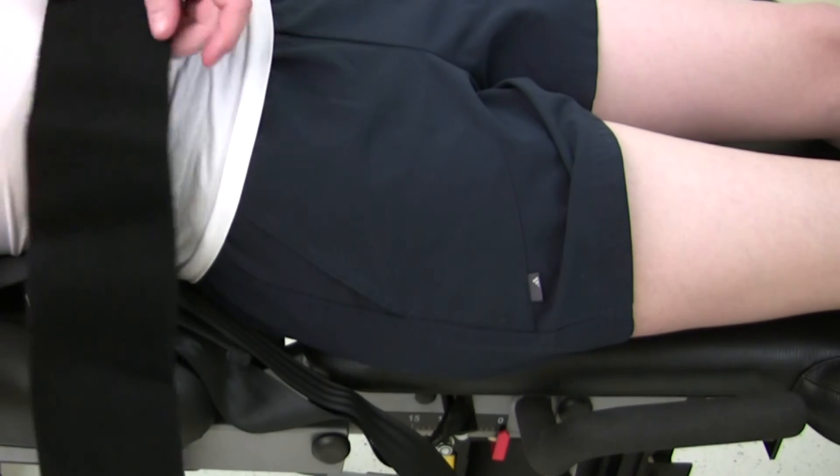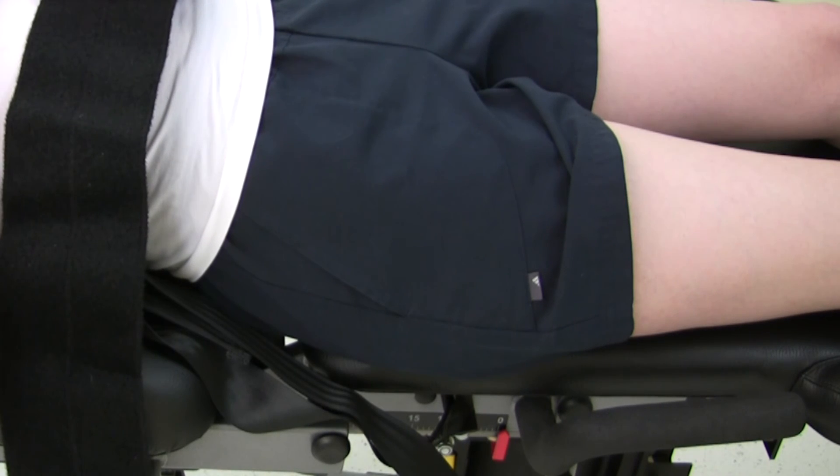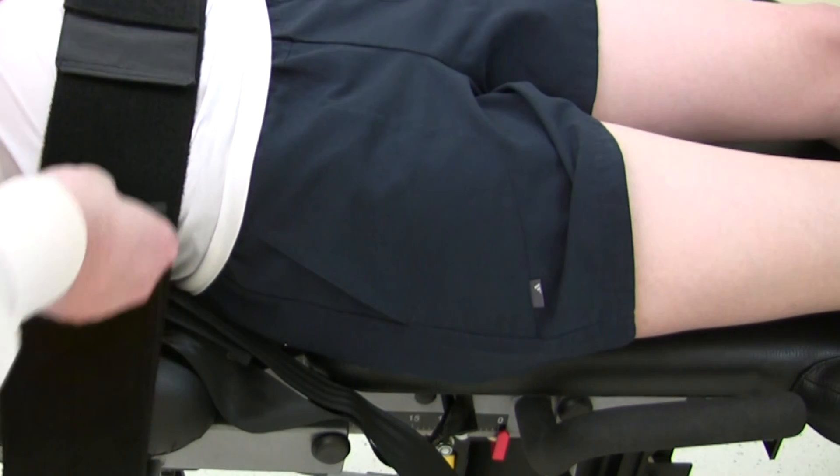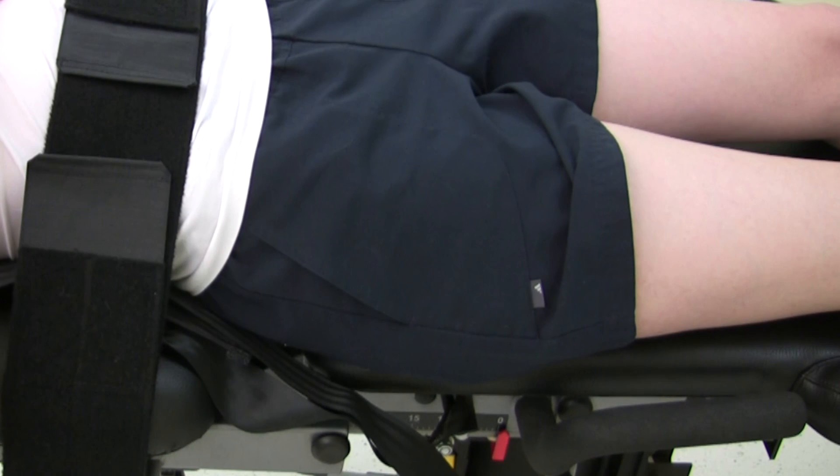Finally, if required, attach the lap belt by looping around the chair handles. The subject may also use the long handles on the chair back to aid stability.